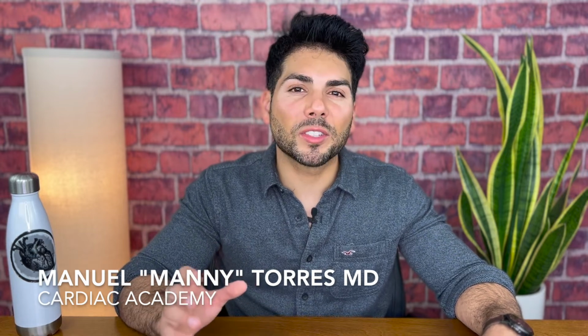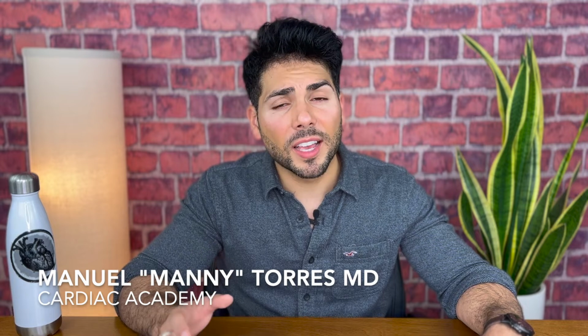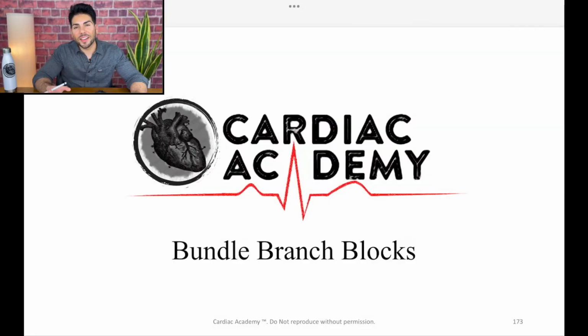In the last video, we started our discussion on conduction blocks, more specifically AV blocks. So in this video, we're going to continue our theme on blocks, however, we're going to talk about bundle branch blocks. As always, we're going to take everything and break it down into simple, easy to follow steps. So let's get started. Alright, let's start talking about bundle branch blocks.